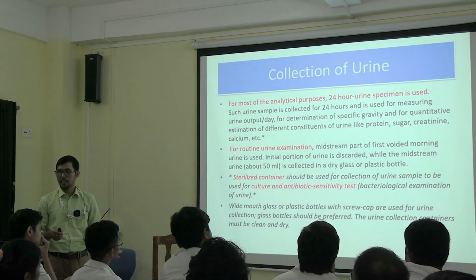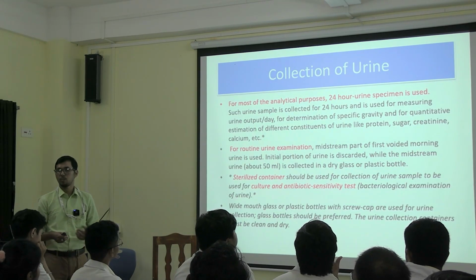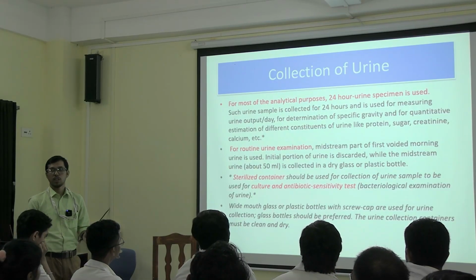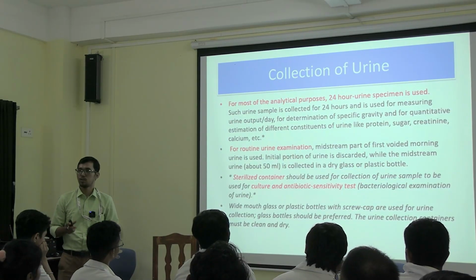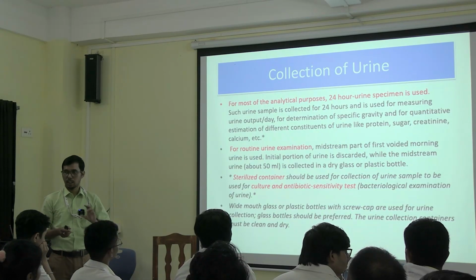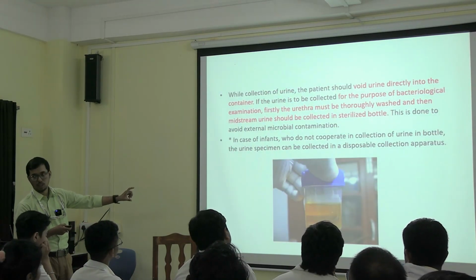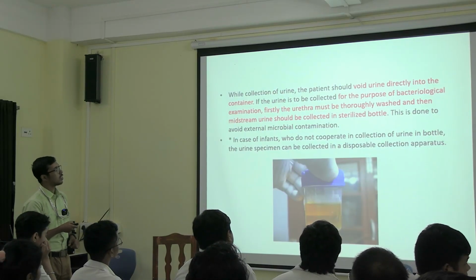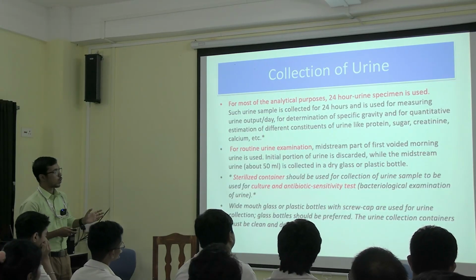Let's say you have a high grade fever and you have burning micturition. When you pass urine, you have a burning sensation. It is most common in females. So in this condition, the doctor will prescribe urine for microscopy and culture. For microscopy, you will not be collecting 24 hours. They will give a small collecting vial or a pot like this, in which you will collect and give in the morning.